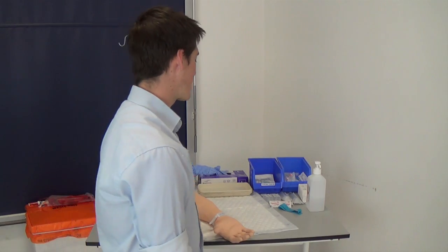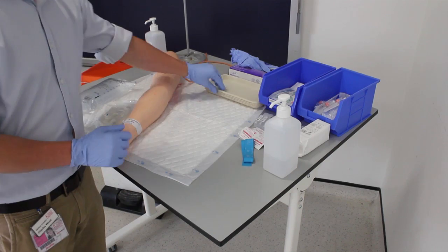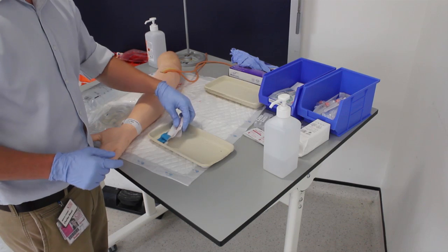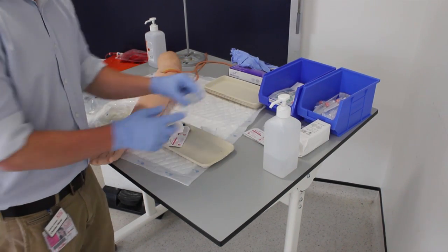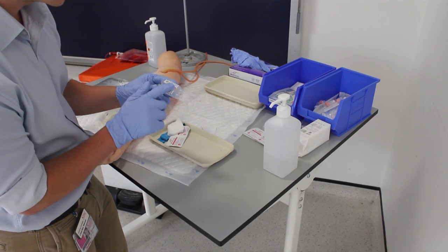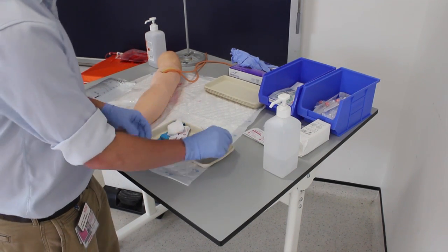To begin with, it's important to gather the right equipment. I've started off by washing my hands and putting on some gloves. I'm going to take this tray to hold my equipment and into it I'm going to put a tourniquet, some alcohol wipes, and some gauze, and then get some sterile saline to act as a flush. It's important to confirm by looking that this is sterile saline and also to check the expiry date — it's useful to confirm this with a colleague if you can.